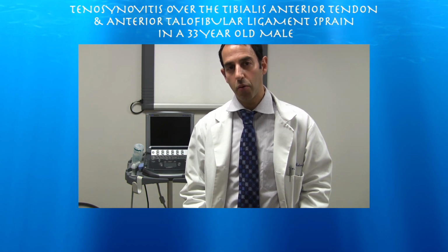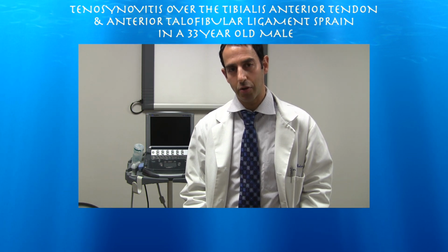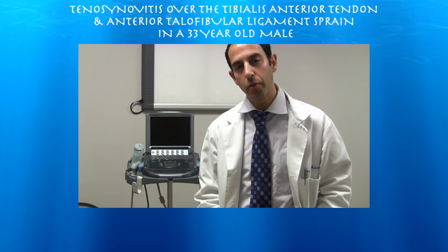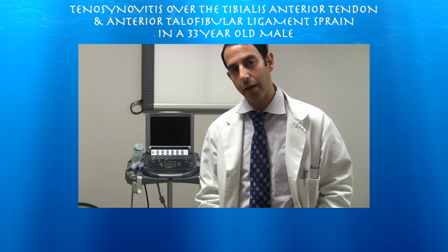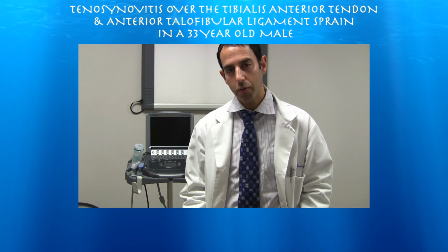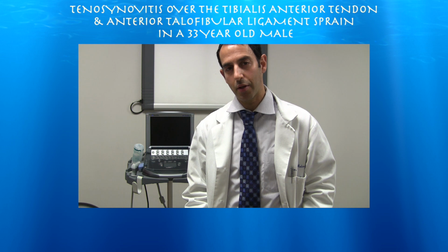However, upon further review and after getting an MRI, he essentially had tenosynovitis of the tibialis anterior tendon. Also, looking back at his ultrasound, the fact that the fluid is pretty much spread out and kind of diffuse over the tibialis anterior tendon goes against the ganglion and is more in favor of tenosynovitis. Also, he suffered from a severe sprain of the anterior talofibular ligament as well as the deltoid ligament.